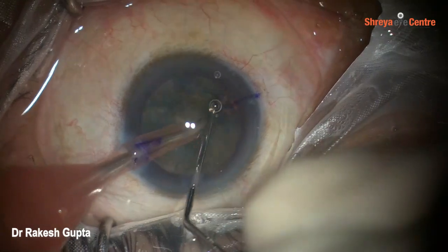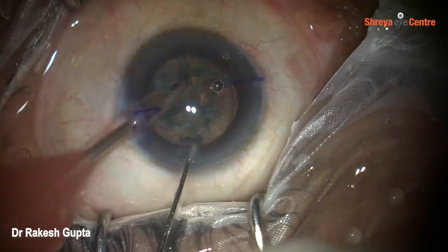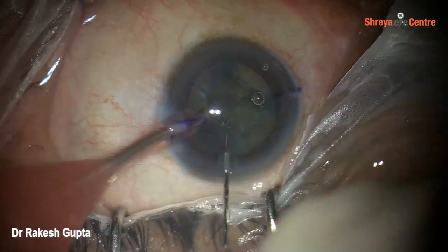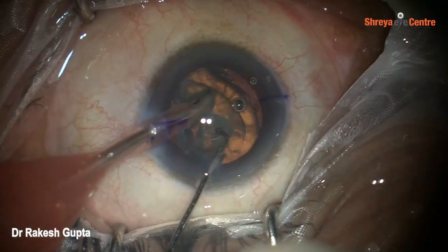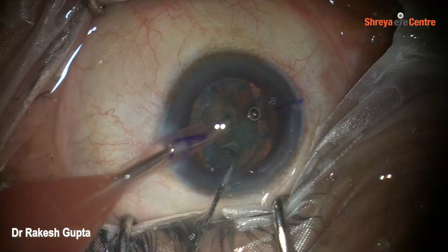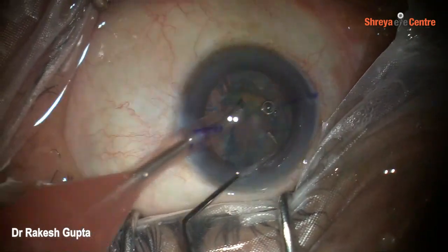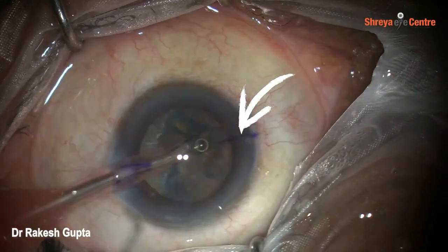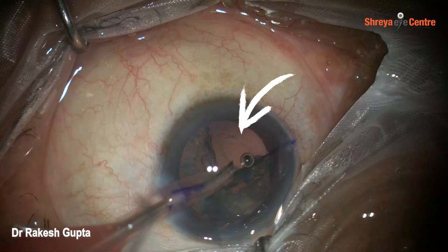But if we hold our nerves and keep patience, then it is still possible to continue with our primary plan. So friends, as you can see, everything is going very smoothly. After doing toric marking, capsulotomy has been done perfectly, hydrodissection is done, nucleus has been rotated, and everything looks like it is going very smoothly. But now you just observe, there is going to be a complication at this moment. And yes, you can see this posterior capsular rent infranasally.